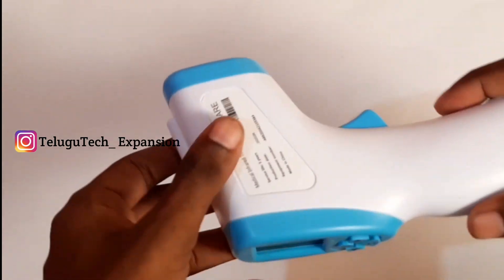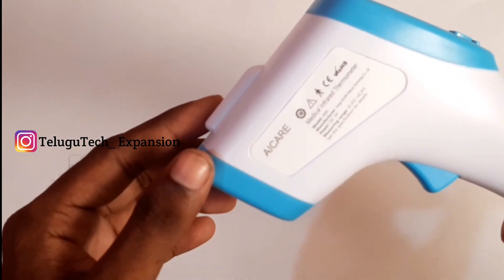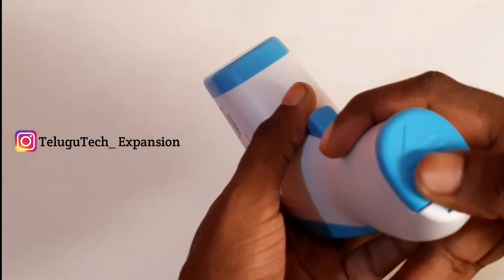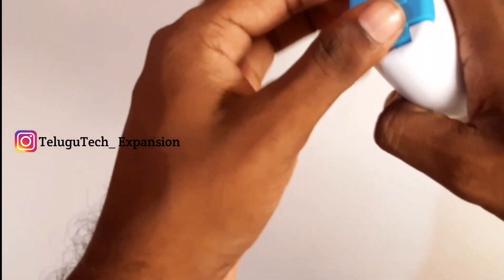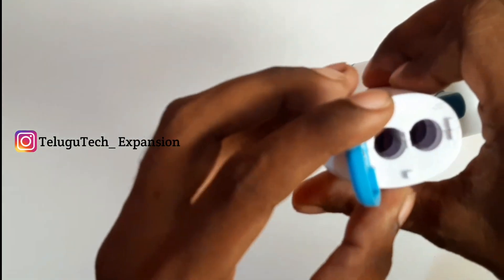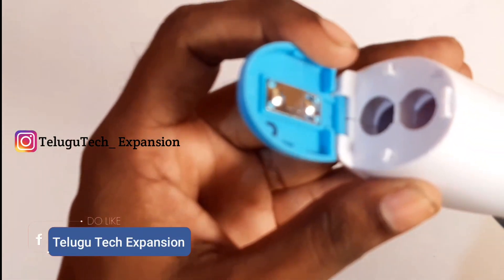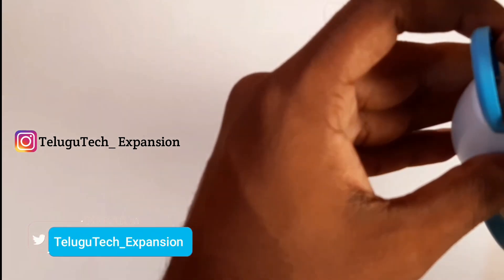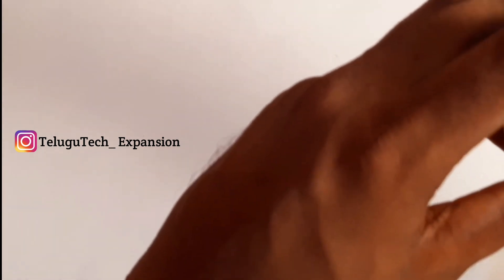This is my product. This is the display — I have a blue color display. I will show you the display. I will press the battery. There is an indication. Here is the device — there are batteries.